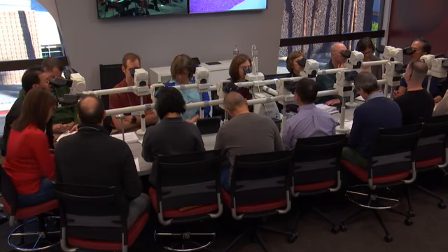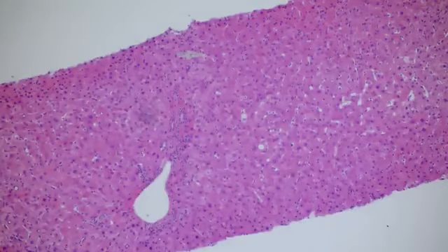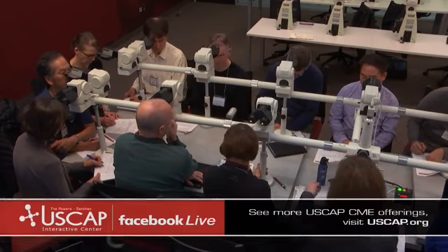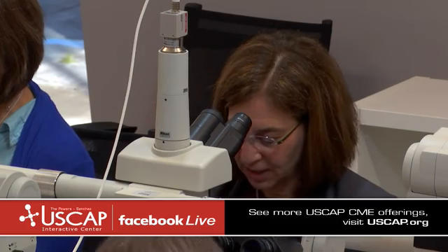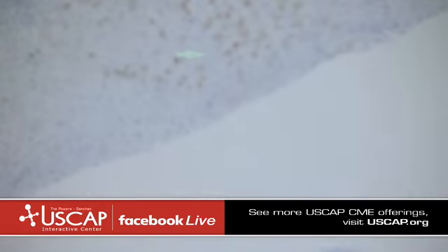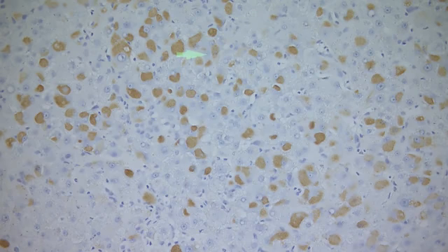And that would be how I'd sign this one out because I knew the labs. You could do, and I brought with me so you could see what the hep B surface antigen looks like if you want to do this stain. It works very nicely. So this is in the area that we looked at before, and you could see how obvious and how bright this is, how good the stain is. So if you need it, it's there. Most of the time, you're probably not going to need this, but if you do, it's there.